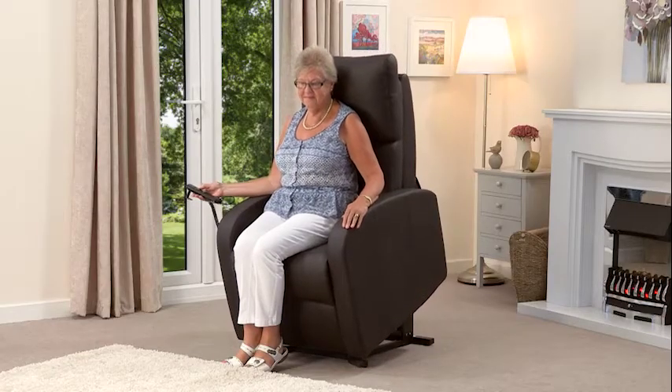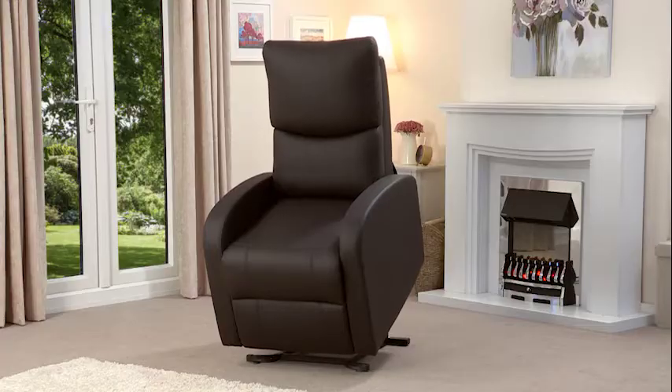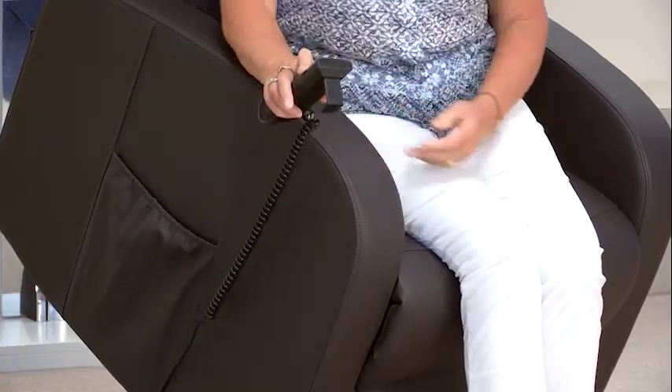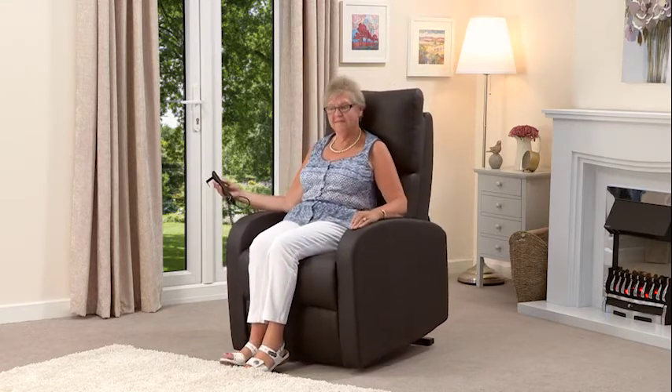Operating the Melbourne couldn't be simpler. There's an easy to use four button handset. The Melbourne rises right up so that all you need to do is lean back against the seat, and then by pressing the recline button it will gently lower you from the highest standing position down into a normal seated position.